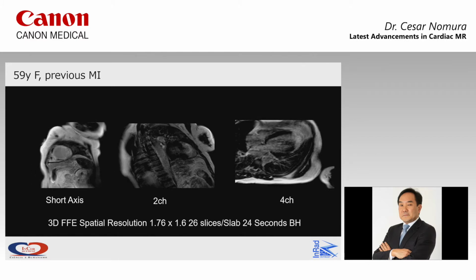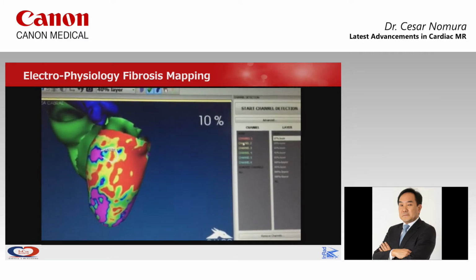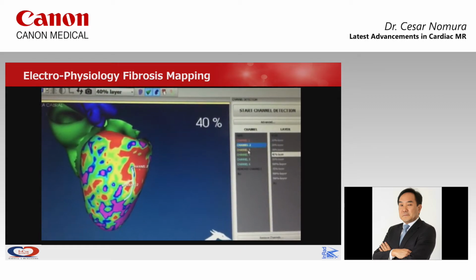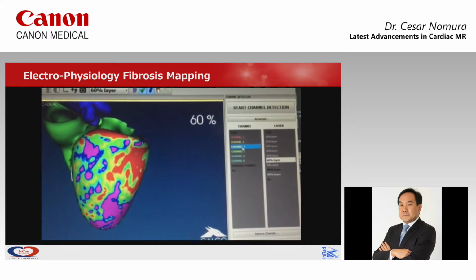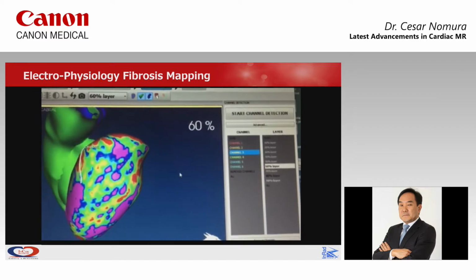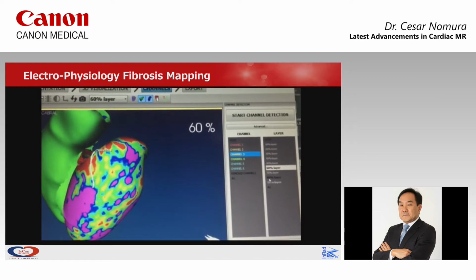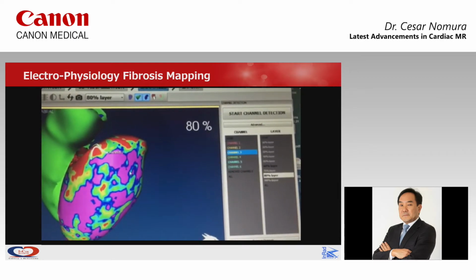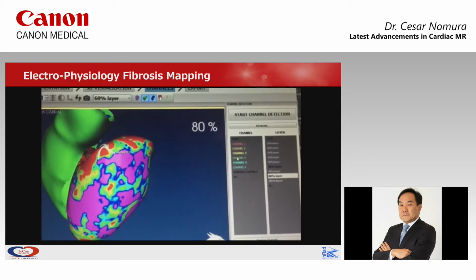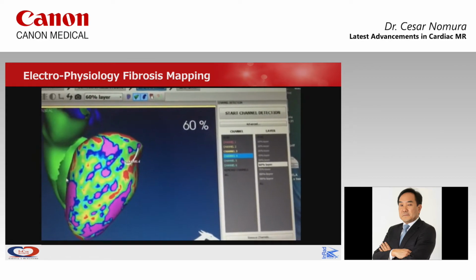One thing that it would help is in the mapping. So I think the 3D late enhancement would help in the electrophysiology fibrosis mapping. So it's important to understand where the fibrosis is, and it can help with the positioning of the leads, also when you want to install a pacemaker, and for the electrophysiology study, so they can find where the area of fibrosis is.